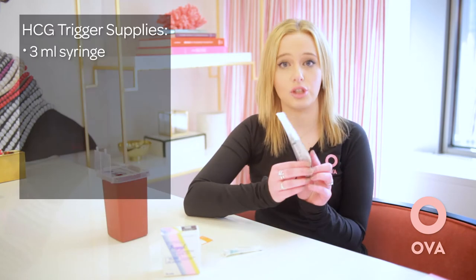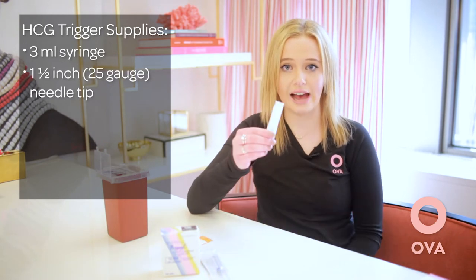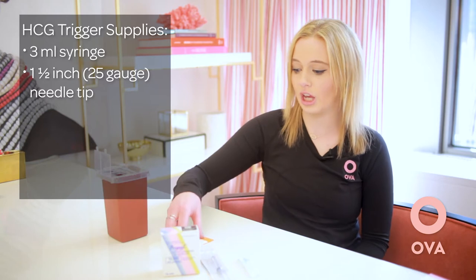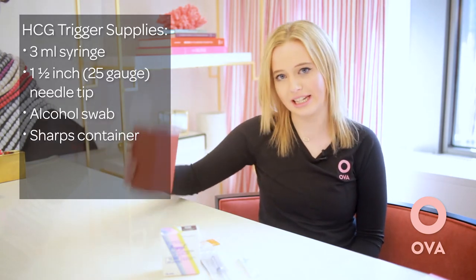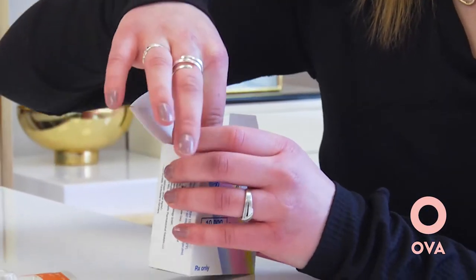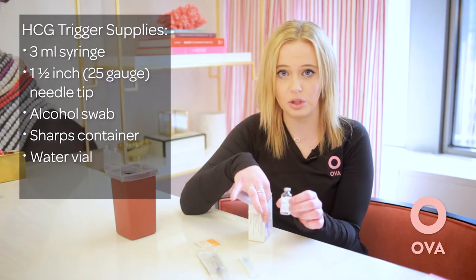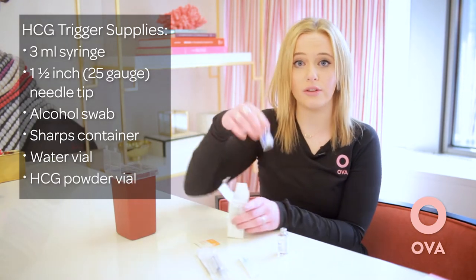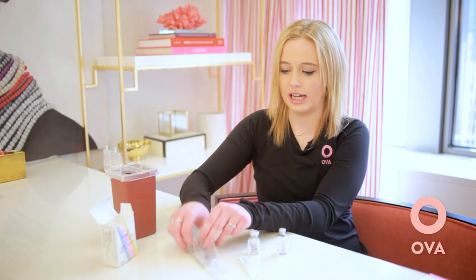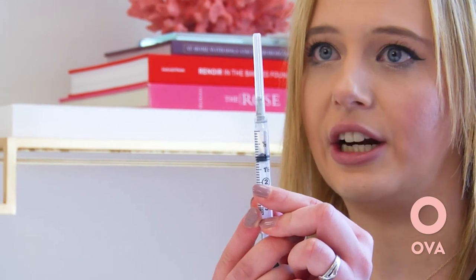You're going to need your three milliliter syringe with an inch and a half needle. You're going to need an additional inch and a half needle used for administration. You're going to need an alcohol swab and your sharps container. First, grab the medication and take it out of its box. Within this box you have one vial of water, which is used to reconstitute the medication, and one vial of powder. You may have two vials of 5,000 if you're using the 10k dose. First, take your syringe and draw back to one cc or one milliliter of air.